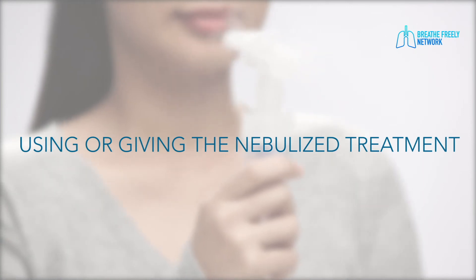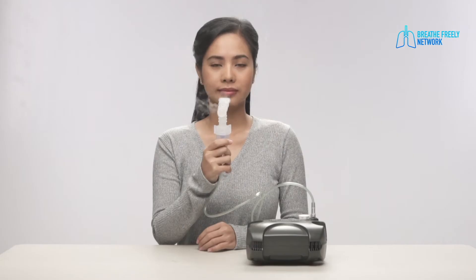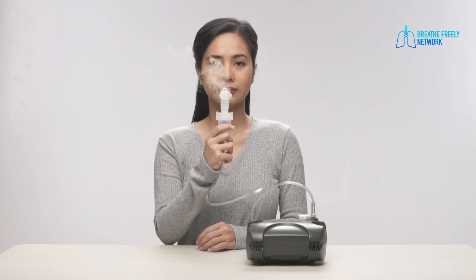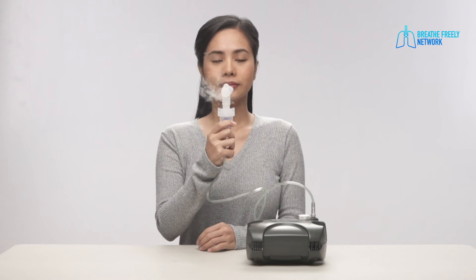Using or giving the nebulized treatment. Hold the mouthpiece and medicine cup upright to help deliver all the medication and so the medicine does not spill out. Make sure you are sitting up to take the neb. This will let you take deeper breaths to get more medicine into your lungs.